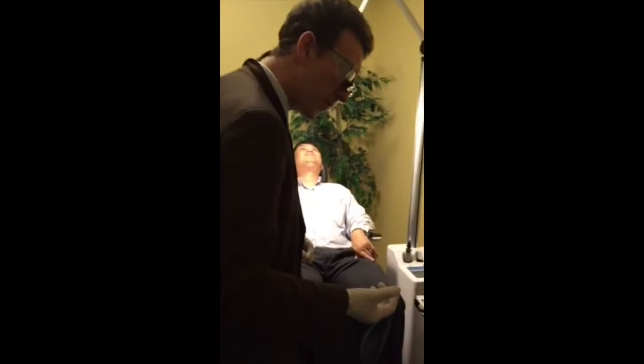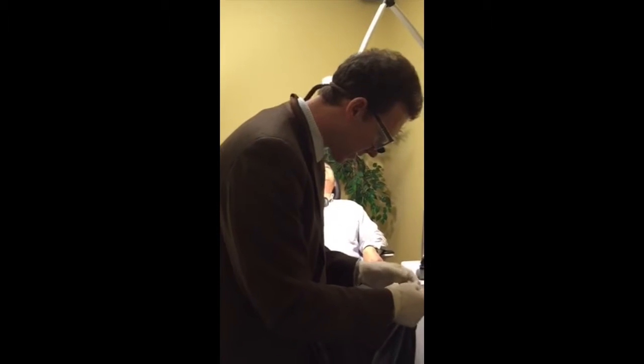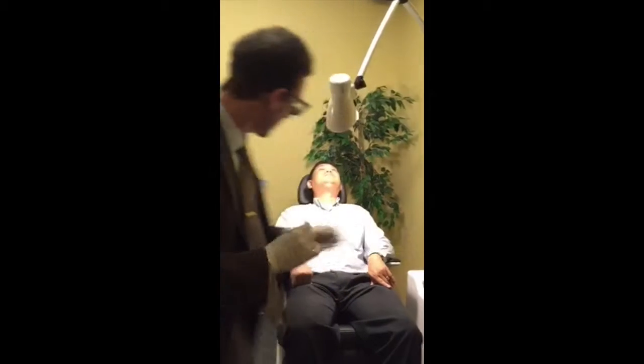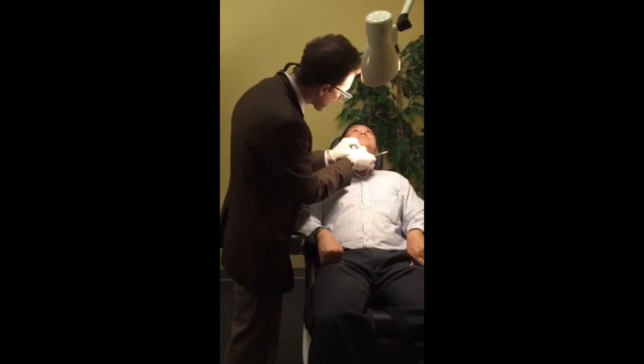You have some 4x4s and cotton balls for me. Yeah, you can put the cotton ball. Okay. So we're starting, wow, there are a lot of syringes here. Okay. So the nice thing that we do to make this comfortable for him is that we've already numbed him with anesthesia, so that's going to make it easy for him. And I'm just going to tap this here just gently so we clean everything off.